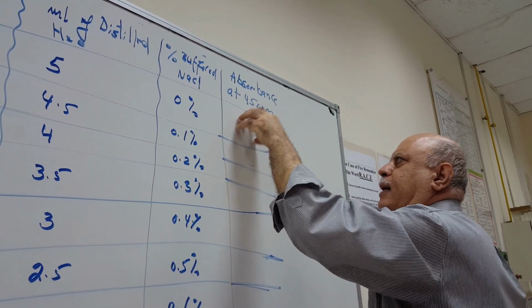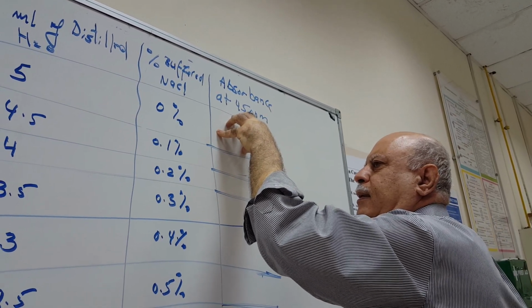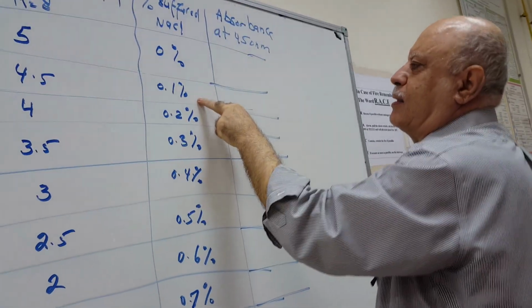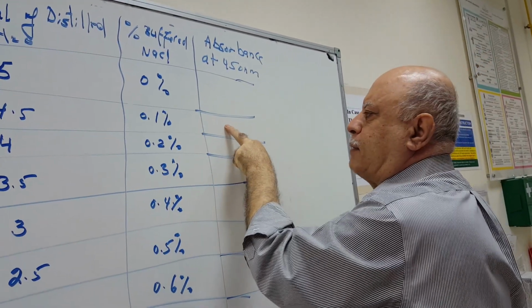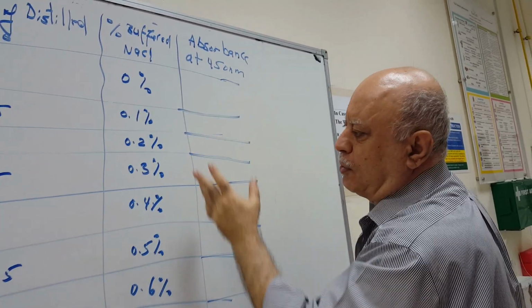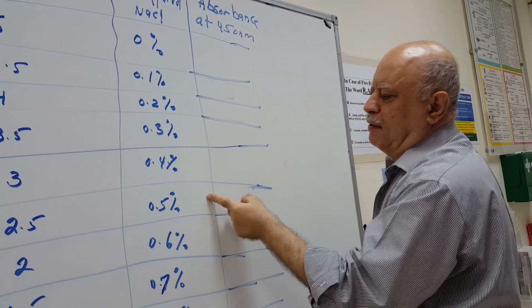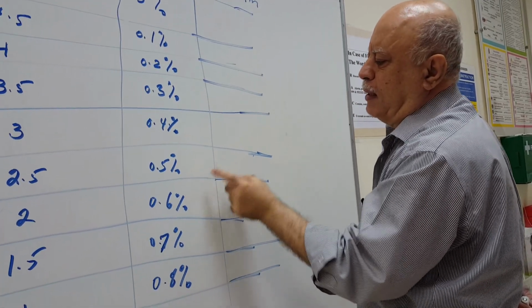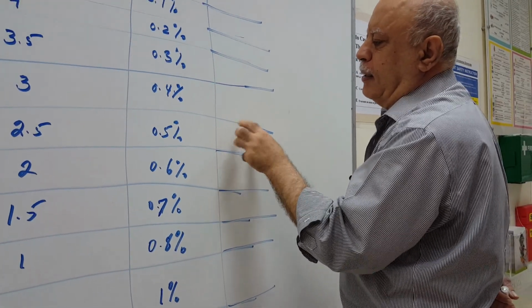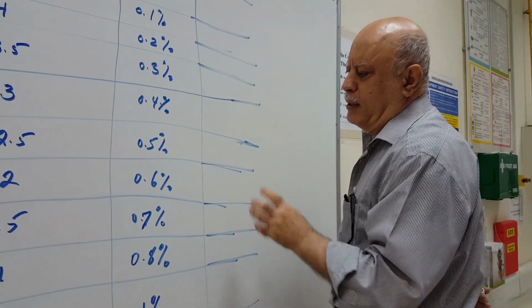So 100% of the cells will burst. We have 100% lysis, hemolysis. Here, still very hypotonic, we expect close to 100% lysis. Here maybe 80%, God knows. Here, at 0.5%, maybe 36%, we should expect partial lysing of the RBCs and partial still holding. So it depends, we will see.